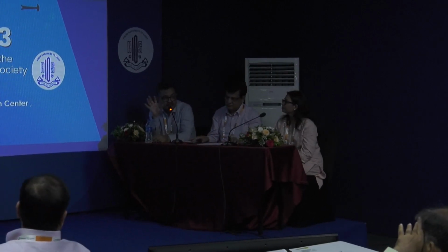So one point I want to highlight for glaucoma is that a single OCT may not be predictive of glaucoma. You have to have serial scans. Number two, how do you correlate the disc, the fields, and the OCT? You must have a disc photograph next to it. Do not analyze glaucoma without a disc photograph or disc examination. Take a red-free photo, which will give you a better clue.